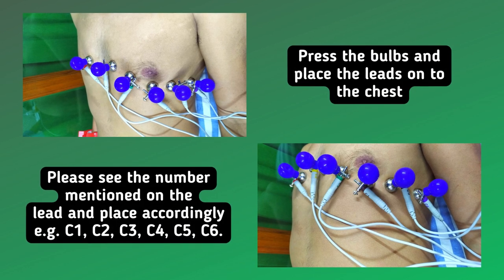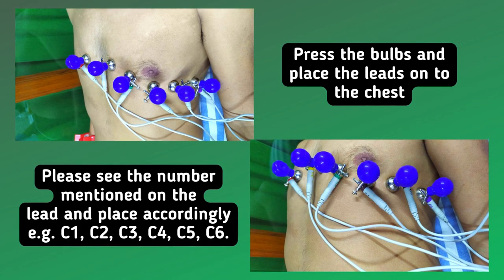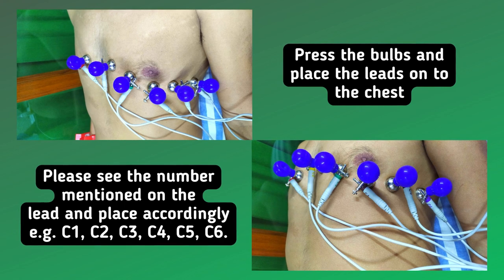Press the bulbs and place the leads onto the chest. Please see the number mentioned on the lead and place accordingly — for example C1, C2, C3, C4, C5, C6.